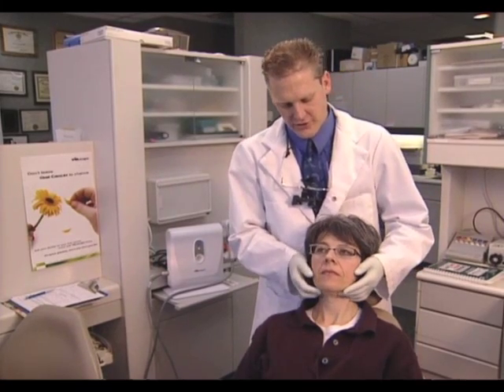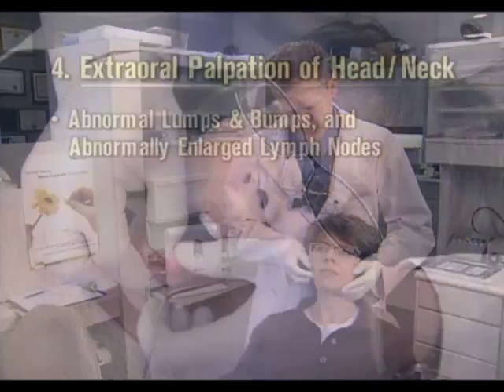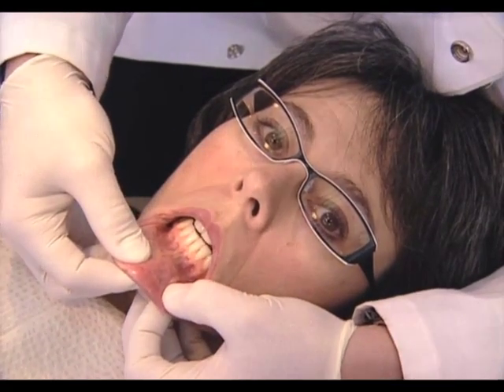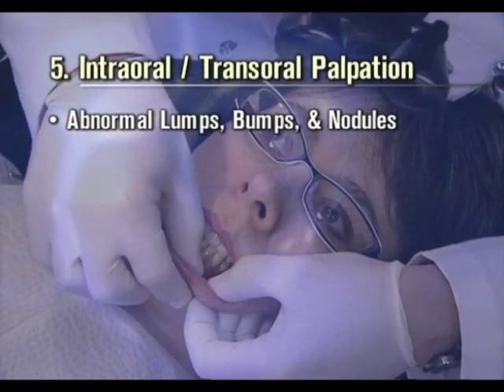Perform an extra oral palpation of the head and neck, looking for abnormal lumps and bumps and abnormally enlarged lymph nodes. Perform an intraoral and transoral palpation of hard and soft tissue, looking for abnormal lumps, bumps and nodules.